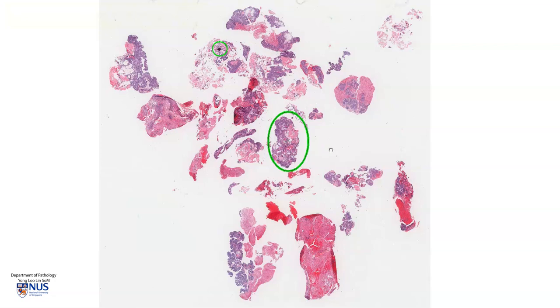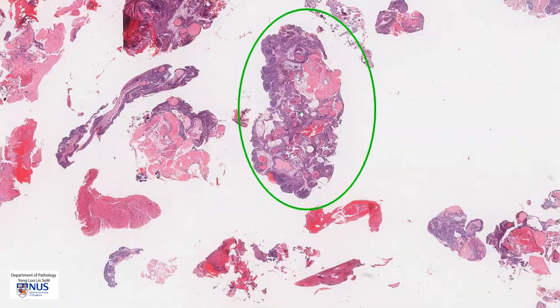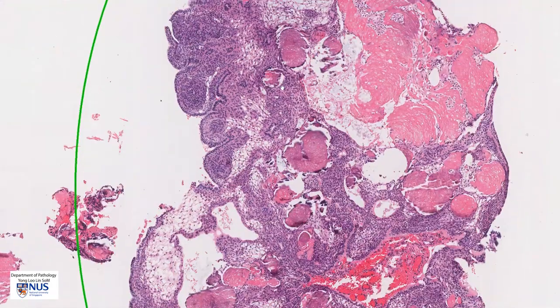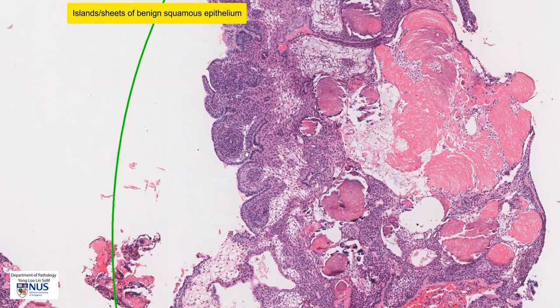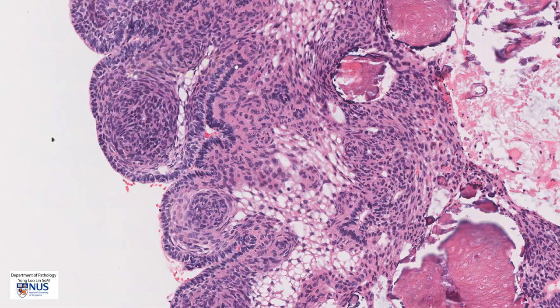At low magnification, we can actually see that there are some pink areas and some bluer areas. These bluer areas represent large islands of stratified squamous epithelium. You'll notice that at the edge of these islands, the nuclei tend to line up in a very orderly fashion. This is known as nuclear palisading — it's almost like they're all standing to attention. So there is peripheral nuclear palisading.